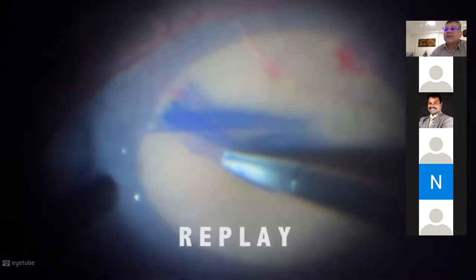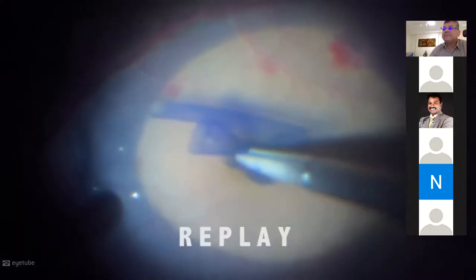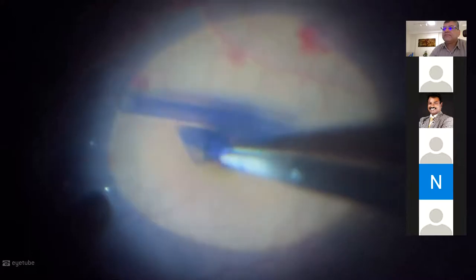You can see there's still a piece over there, but the hole is already filled — so you don't need to keep putting things inside. It's a stuffing technique, a way to deal with the ILM. Since the hole is a large one, the tip will fit in without a problem.